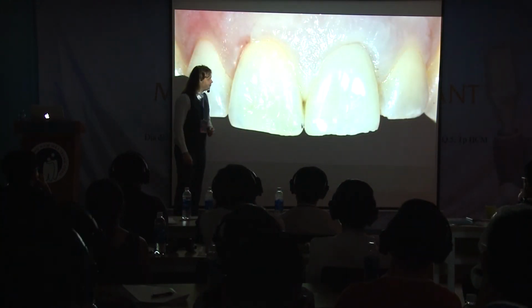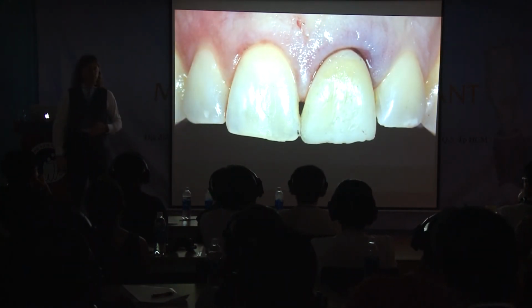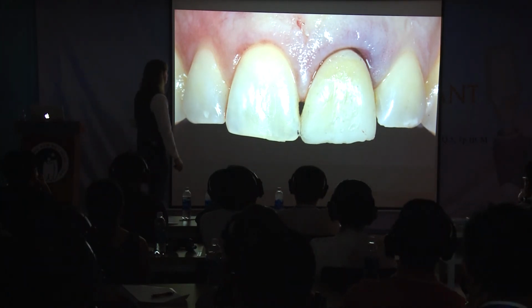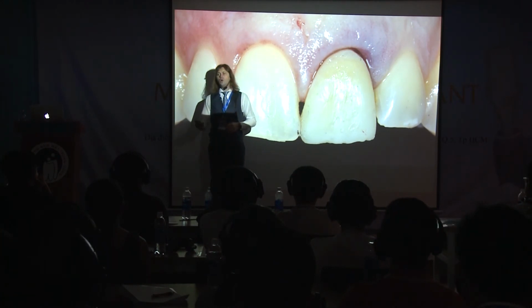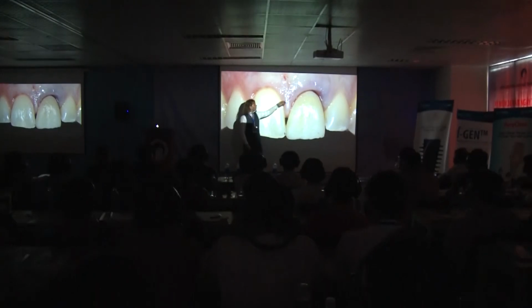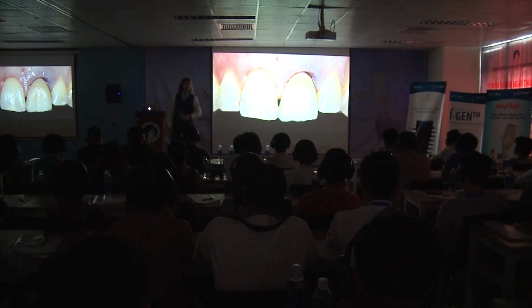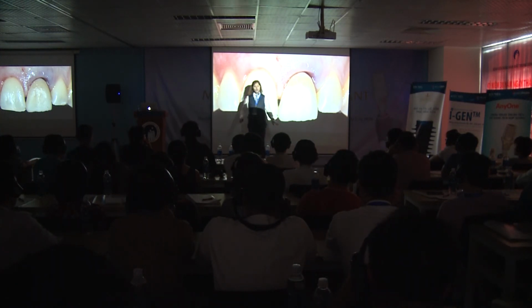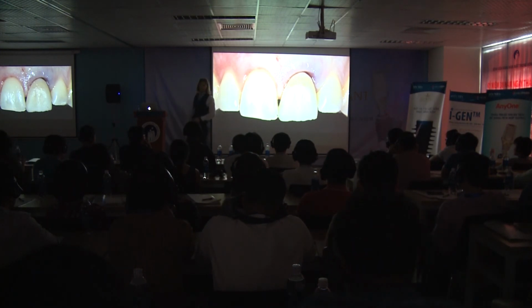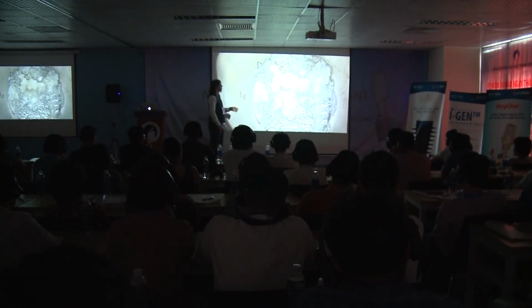This is the provisional, relined. It's my choice to reline it without silicone dam, even if I suggest for those who are not experienced to always use a barrier. Because if the resin goes and touches the implant, you fail. This is the emergence profile, very horizontal. We will talk about this later.